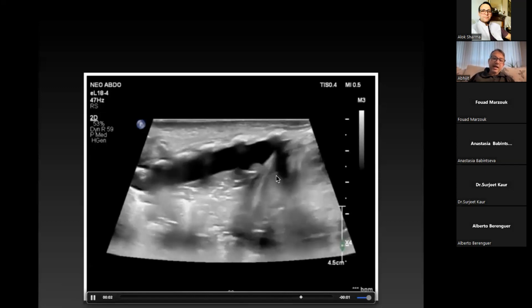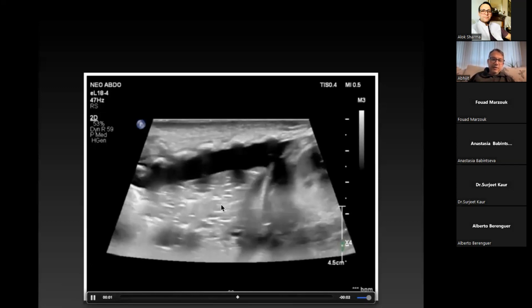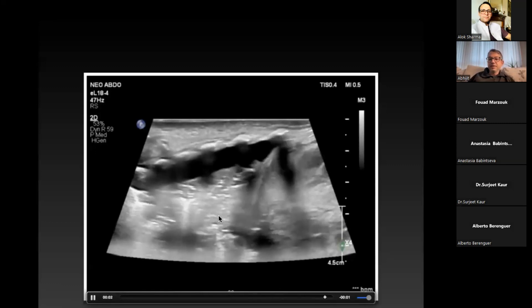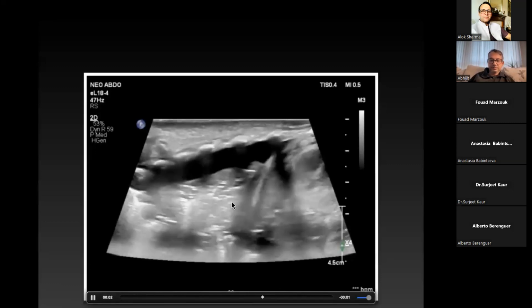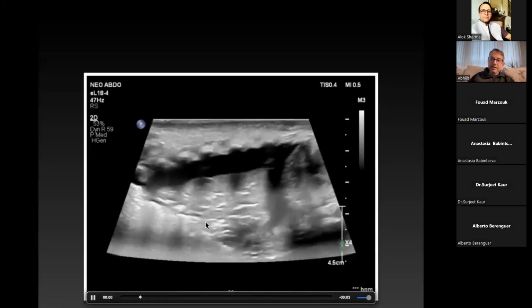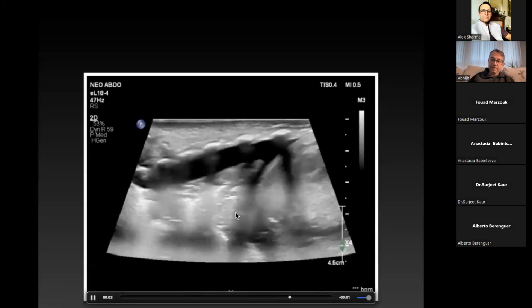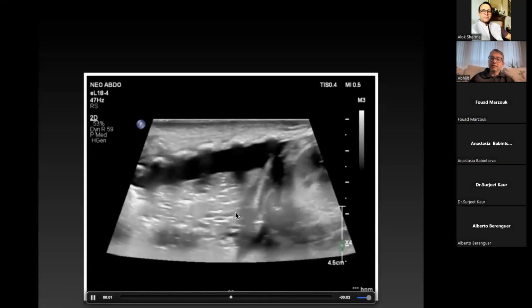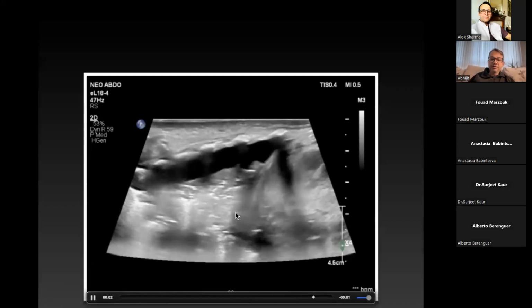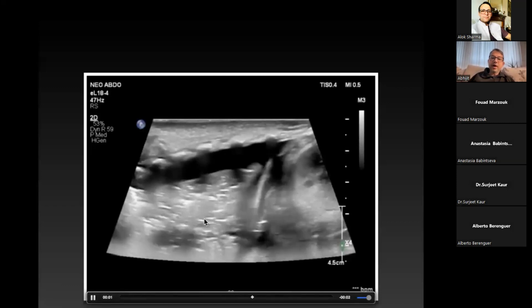And now what you can see here, all these areas are white speckle lines. Again, they come into existence like a tree. There you go. It branched out like a tree and then it disappears. It comes again like a tree and it disappears with the inspiratory and expiratory movement, the classical example of the dynamic bronchograms. Again, air reflects the ultrasound waves, so you see white speckles.